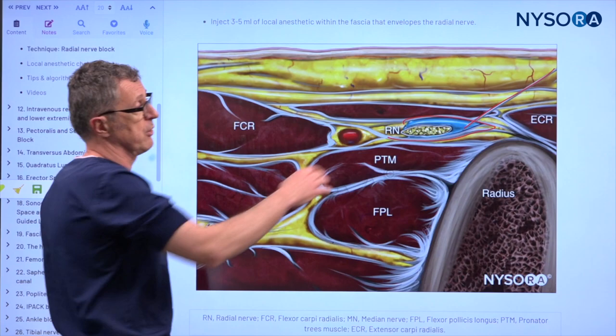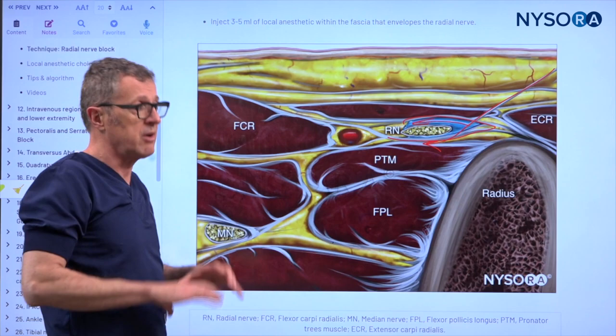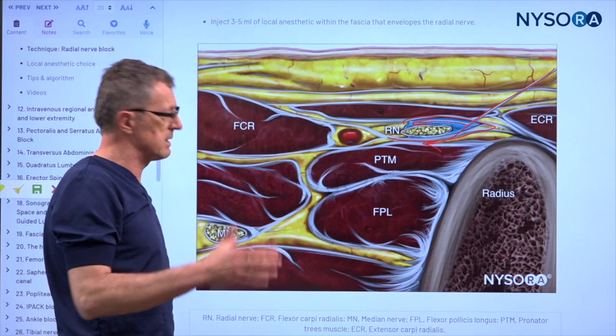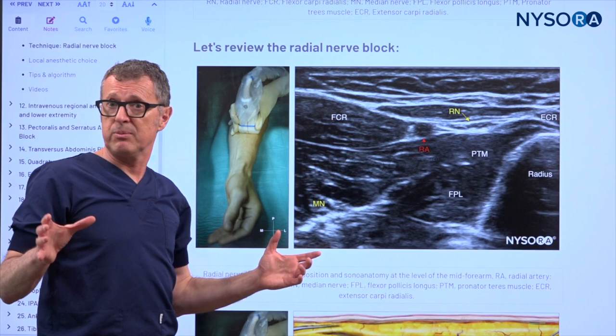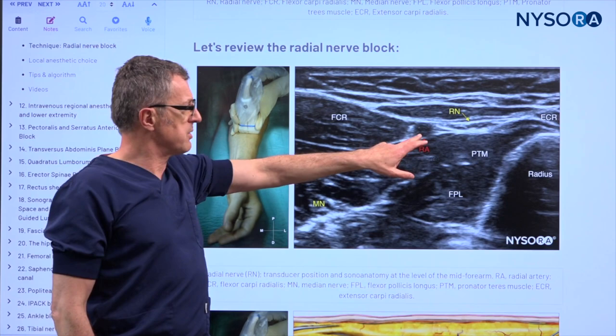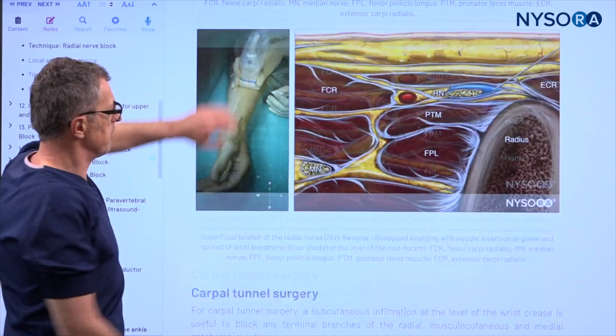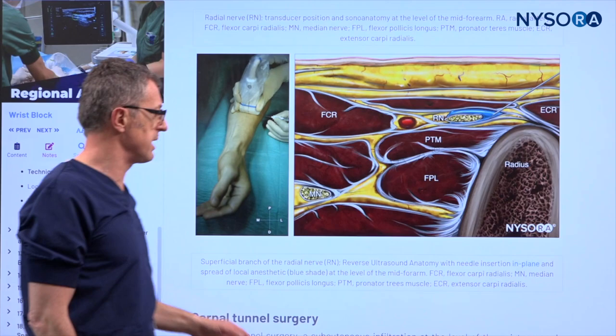This is a very superficial nerve, so you really have to slack off the pressure to allow the local anesthetic to distribute around the nerve. If you apply any more pressure, you will not be able to get that spread — you will obliterate that virtual space, presenting a problem in distribution of the local anesthetic. Let's review the superficial radial nerve block: that's the probe position, the radial artery and superficial radial nerve next to it, and the reverse ultrasound anatomy explaining what we're trying to accomplish.